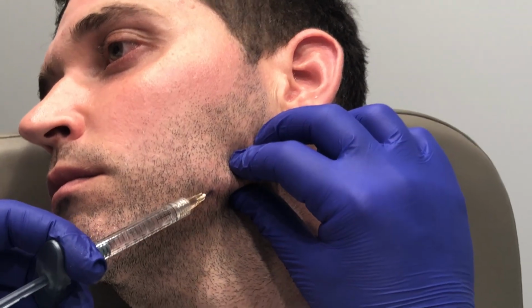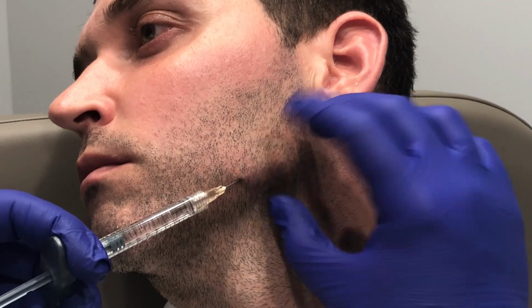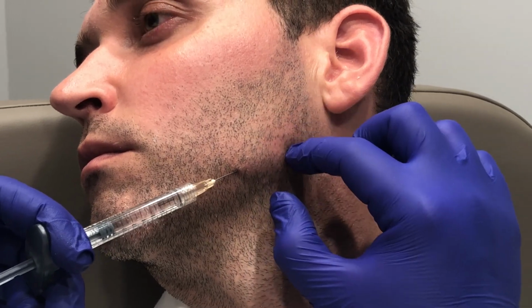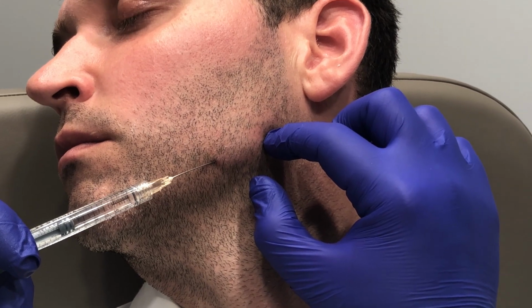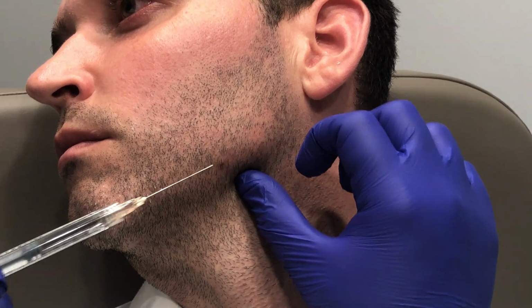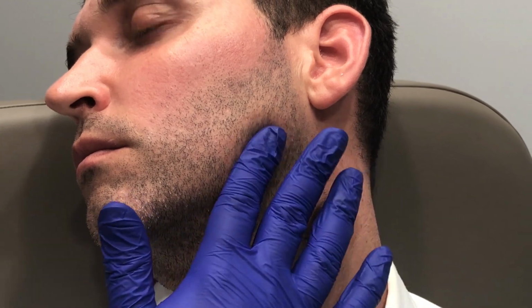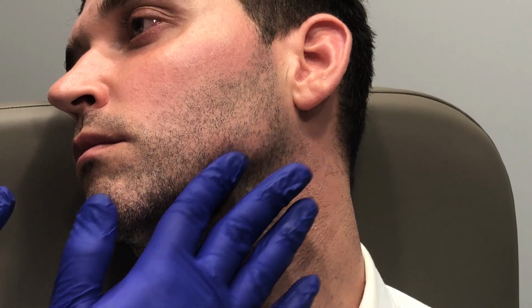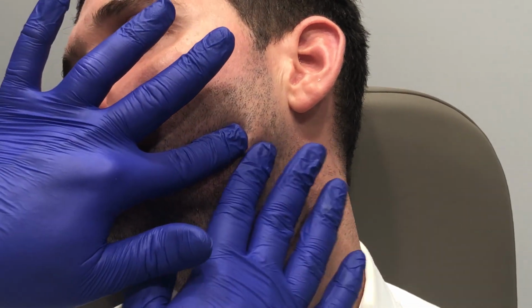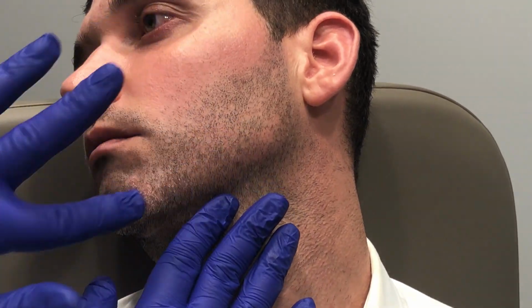Just nicely laying this right along his mandible. Just carefully, you can see we're starting to create some nice fullness back here. Good, and we'll take a look. So you can already see that we've started to just create this nice raised edge right here along his mandible. And we're going to keep working and work centrally now.